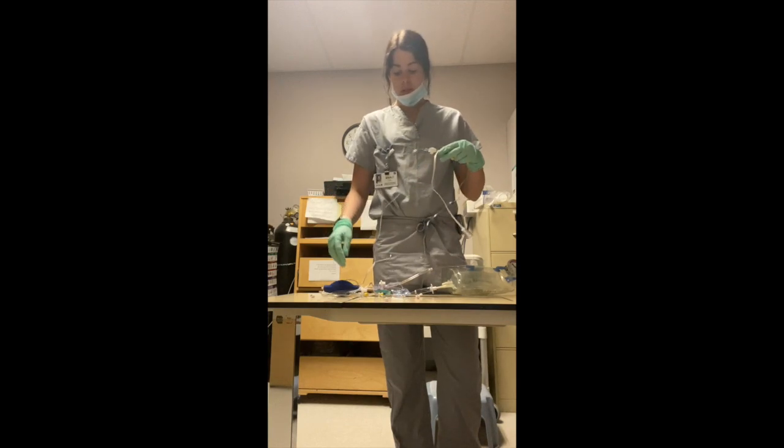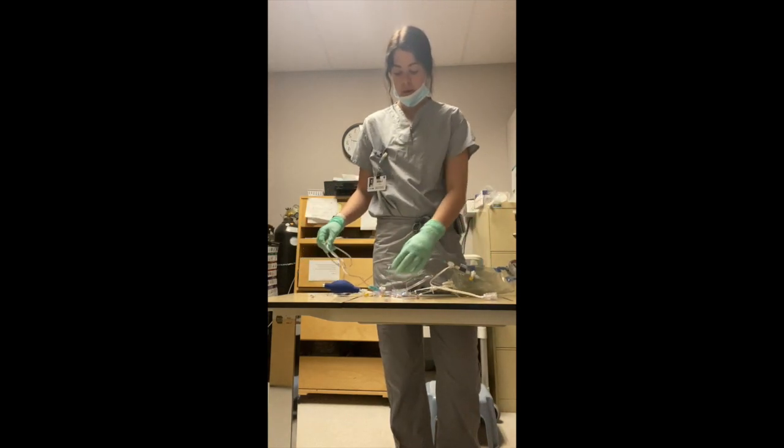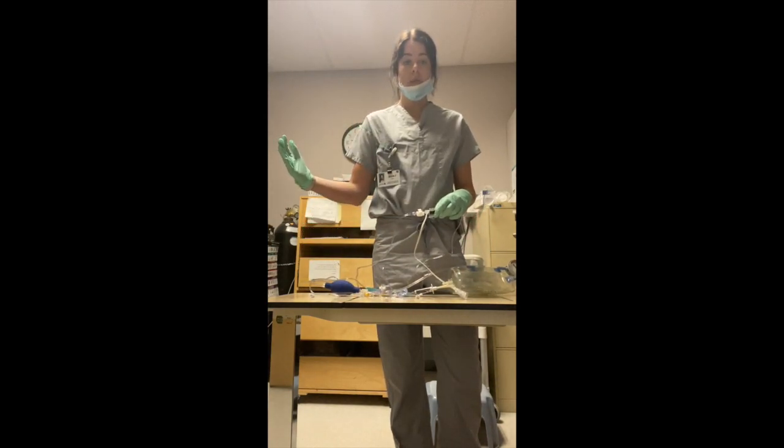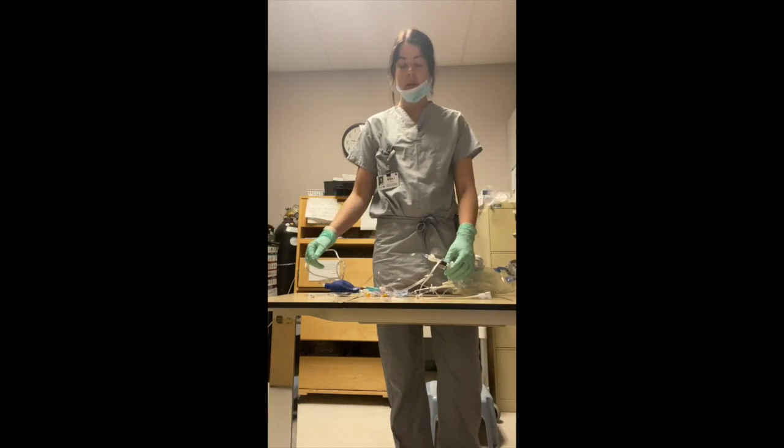To zero this, the stopcock at the end of the line must be off to the patient, so it allows it to be opened to the atmosphere and regulate the baseline pressure.